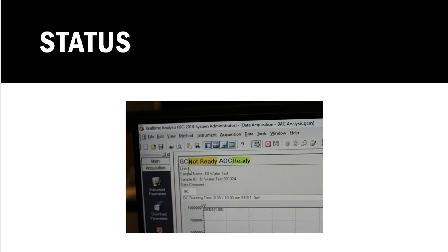All right, so we have started the machine up, meaning we turned the power buttons on, we turned the gas tanks on, we checked all the regulators, and we've got our hydrogen generator that is pumping down. It needs 1 hour before it can generate enough hydrogen for us to actually operate and use the piece of equipment.